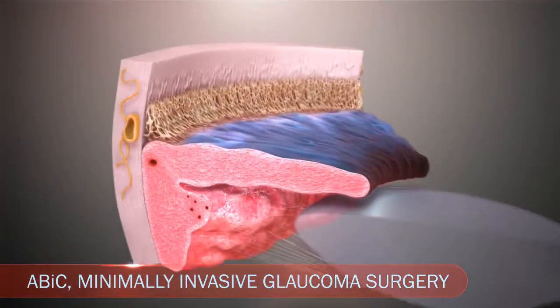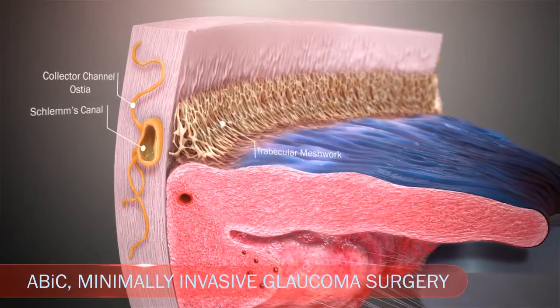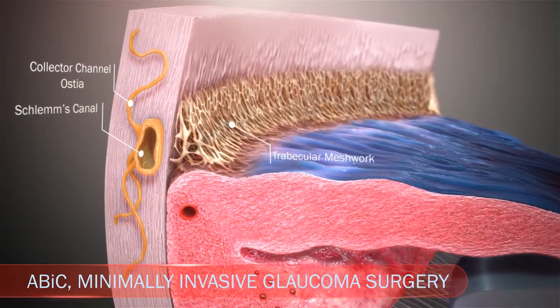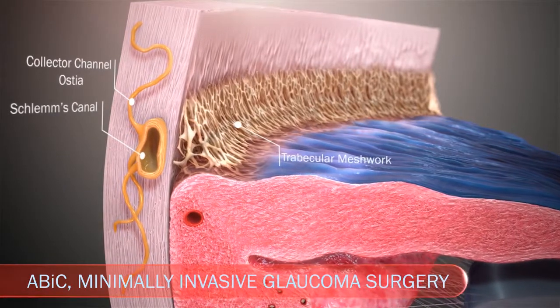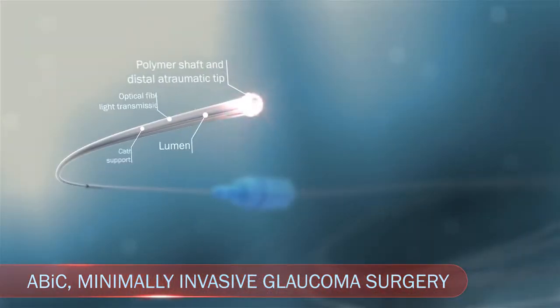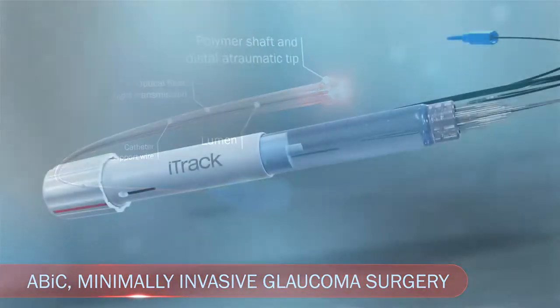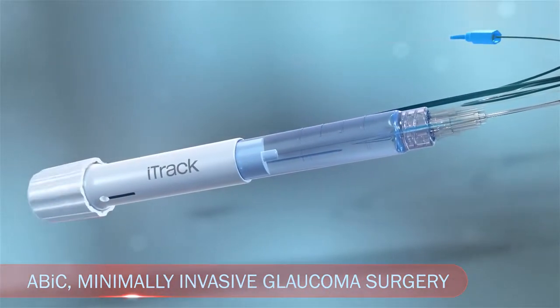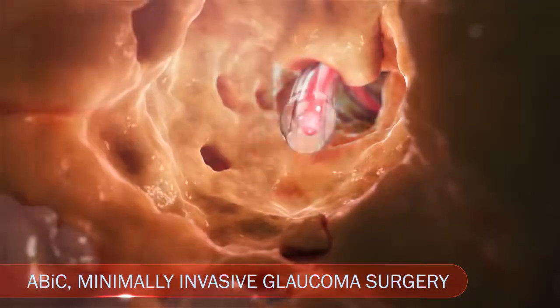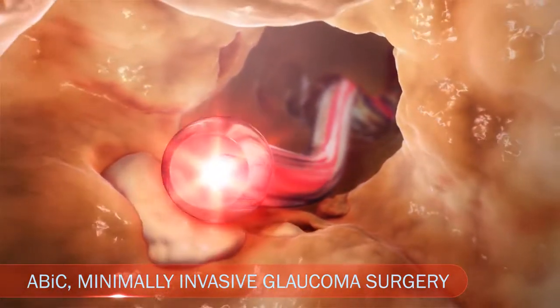A simple three-step procedure, ab interno canaloplasty acts to restore the eye's natural outflow system and does not require a permanent implant or device in your eye. Based on the same principles as angioplasty, ab interno canaloplasty uses breakthrough microcatheter technology to enlarge your eye's natural drainage system, improving outflow and lowering IOP.